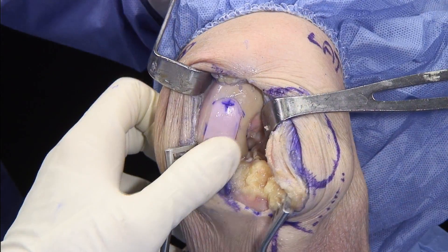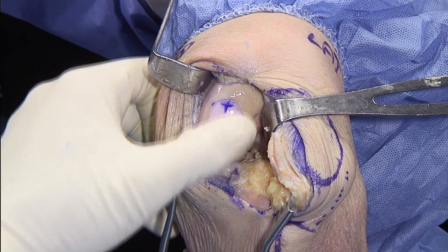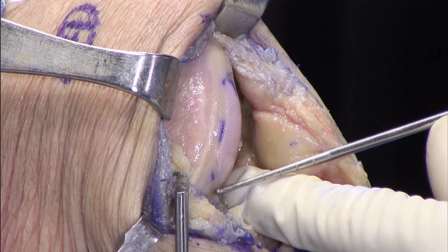From a historical standpoint, this is very similar to what has been done for many years as a freehand osteochondral shell allograft, which I have done. They do work, but technically it is so tedious and time consuming. Now we have instrumentation that allows us to do it in a timely fashion, reproducibly, with excellent fit.